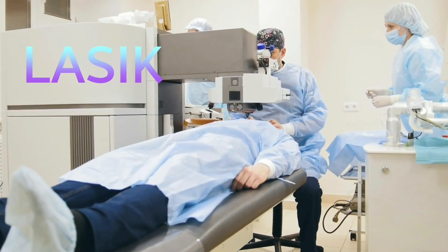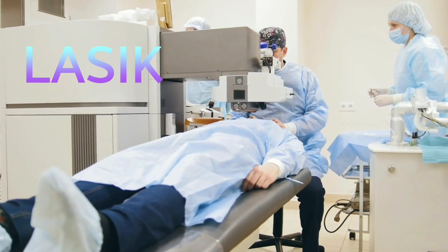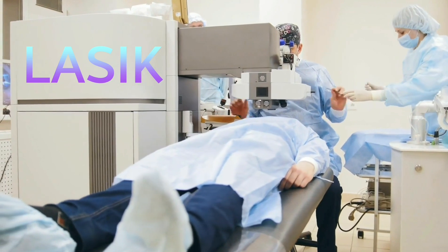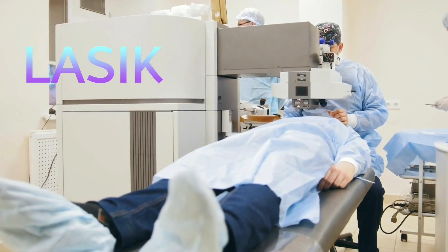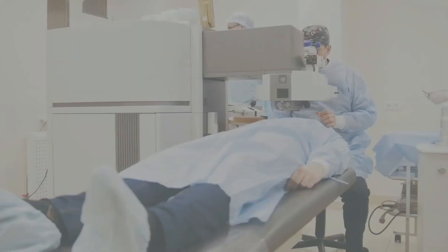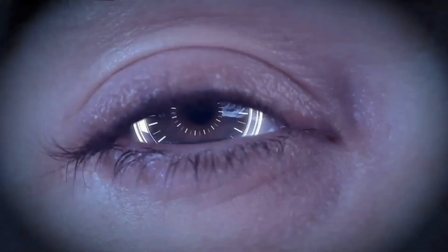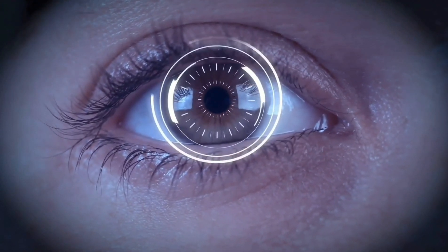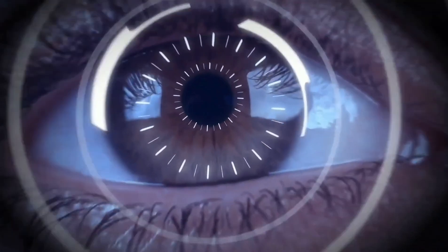It may be you or anybody you know who is interested in LASIK. But what is LASIK and how is it done? Today I'm going to show you LASIK Essential Pearls while watching an actual uncut video of LASIK in one eye. LASIK is one of many corrective eye surgeries that makes use of laser to treat errors of refraction like nearsightedness, farsightedness, or astigmatism. This procedure essentially improves vision, allowing you to do away with eyeglasses for a long time.